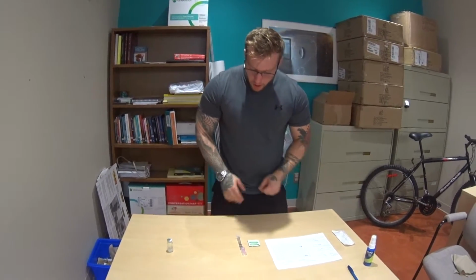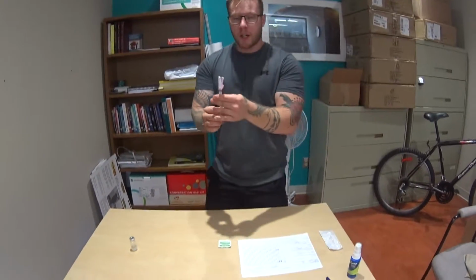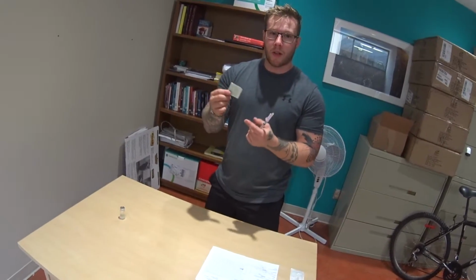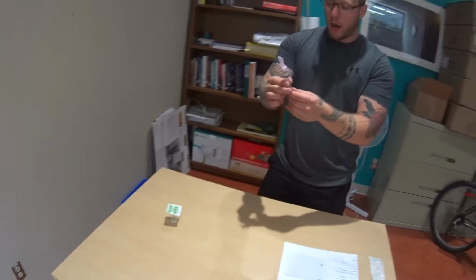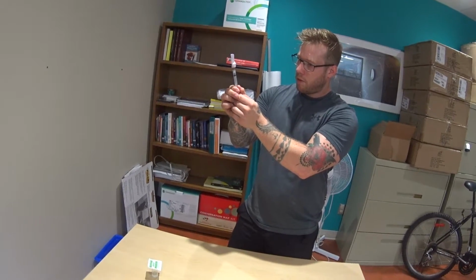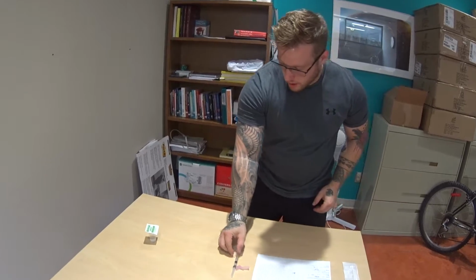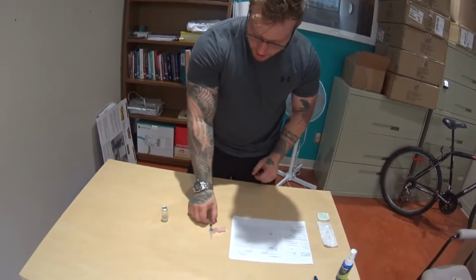Okay, and now we can go ahead and prep the needle. What I'm going to do is draw some air. First of all, I'm going to use this alcohol swab and clean the top of my vial. Now I'm going to use my syringe and grab 0.5 milliliters of air. Set that down. The top of this is clean now. We'll set that aside.